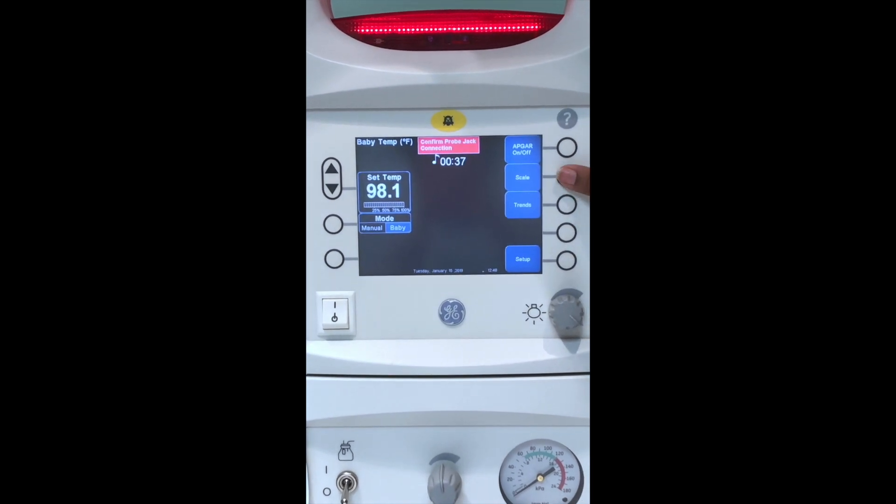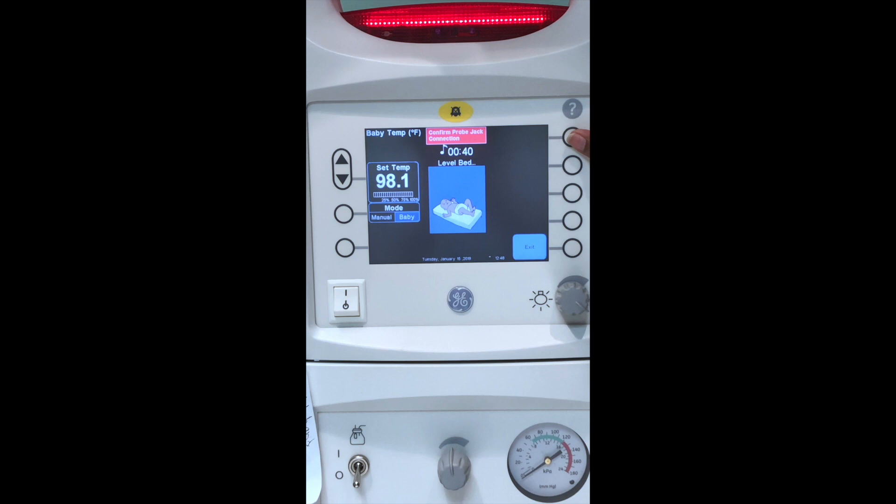We can also weigh the baby here by clicking menu and scale — weigh. And we can zero the bed out and weigh the baby.